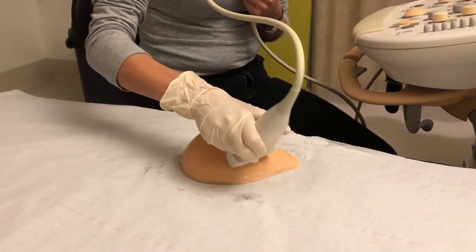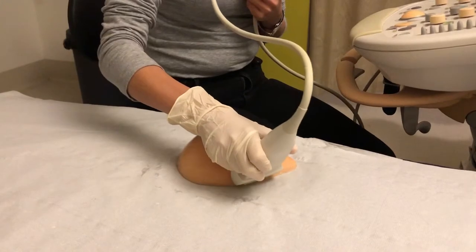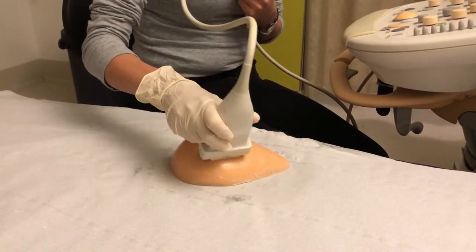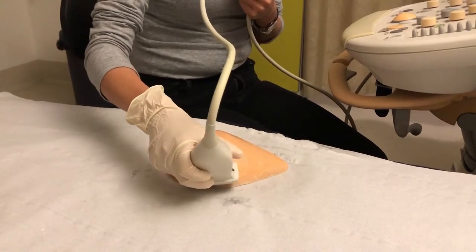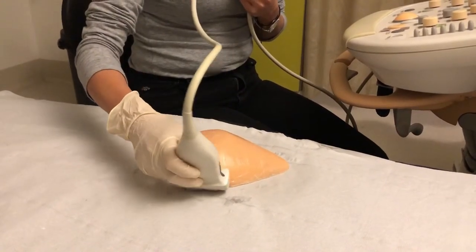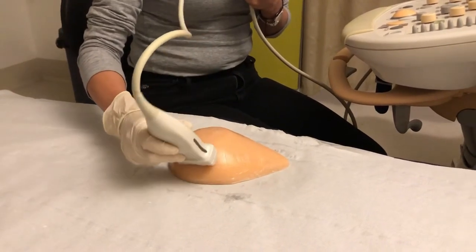Moving slightly more clockwise and repeating the survey towards the nipple, ensuring there is overlap from the previous, and we continue this all the way around the breast tissue until we complete the whole survey.